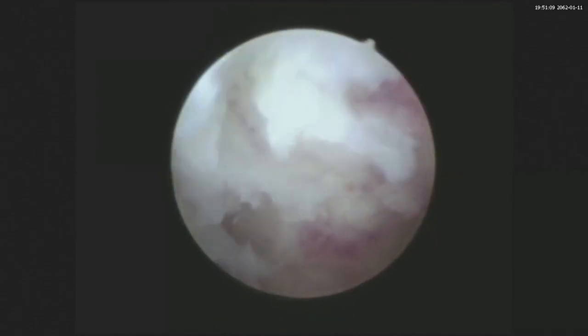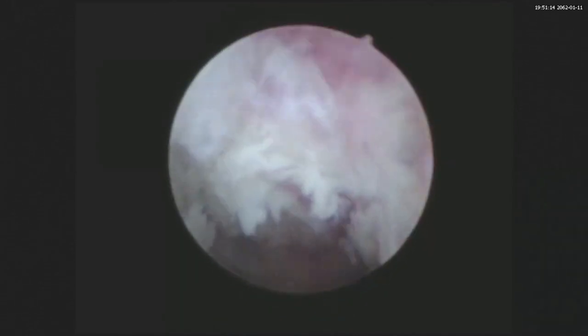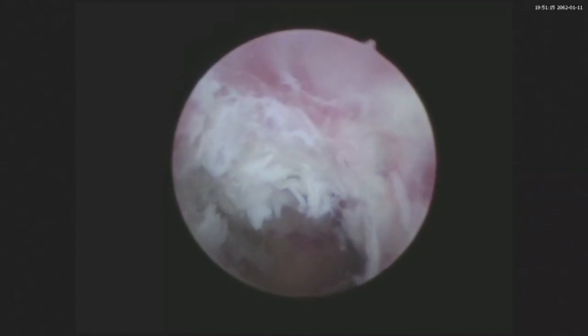When our view is obstructed by tissue cut away from the adhesions, graspers are introduced and the adhesions are removed. At the conclusion of this case, much of the uterine cavity has been restored, but the patient will be brought back for a repeat diagnostic hysteroscopy with possible repeat adhesiolysis in two to three weeks. In cases of advanced adhesions, repeat procedures may be necessary, and performing repeat hysteroscopic lysis of adhesions on an outpatient basis may compound the risk reduction this treatment alternative offers patients.